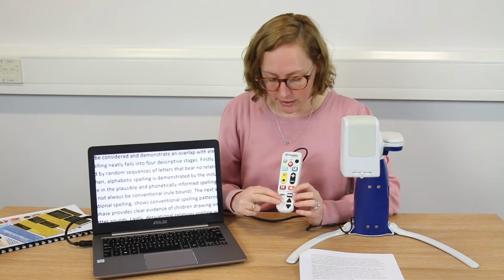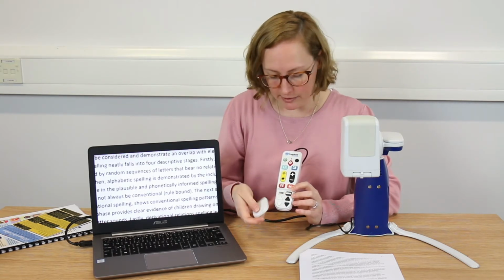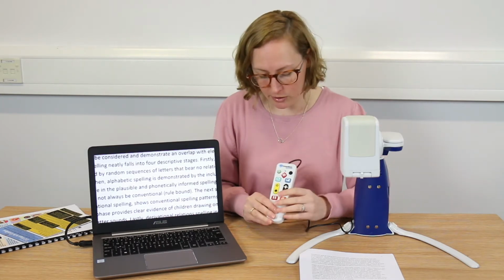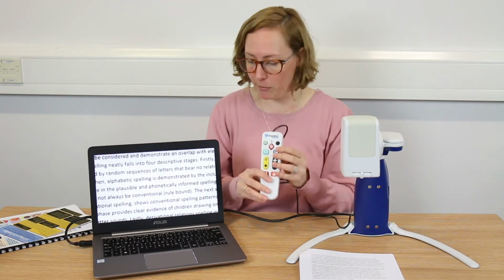The arrows underneath each of those just adjust where the lines are and where the curtains are on the screen, so you can hone in on the text that you want to focus on. But that's the Onyx PhD in a nutshell with the remote control.